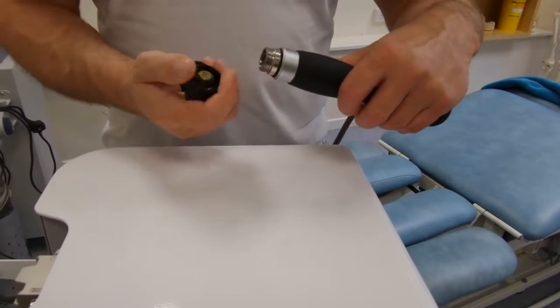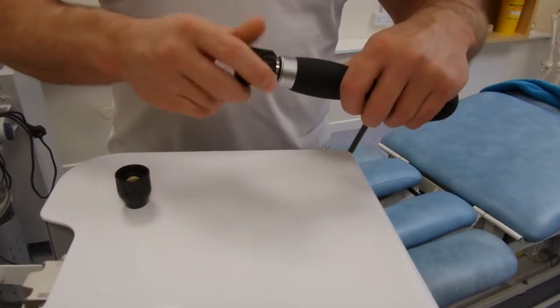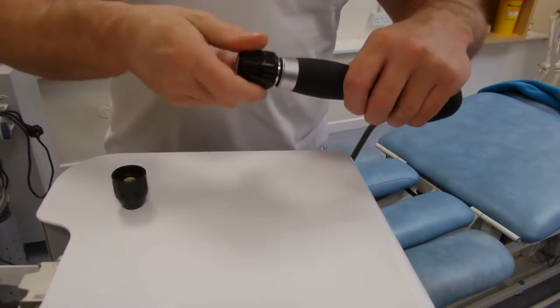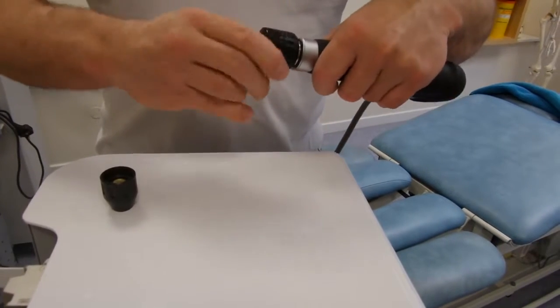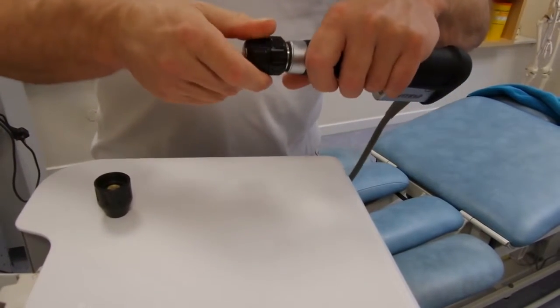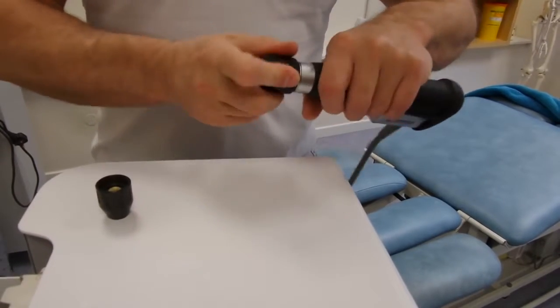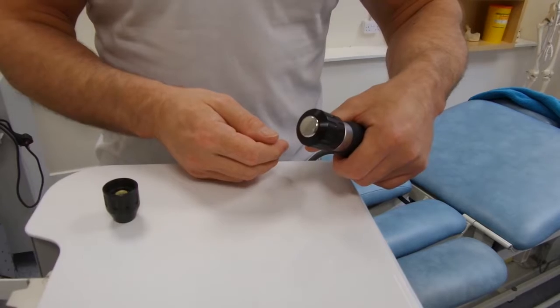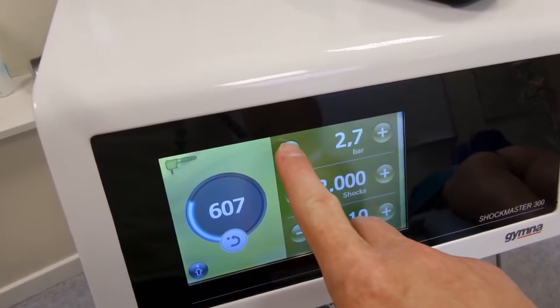We're now going to switch the deep impact applicator and put on the 20mm head. Sometimes the heads can be difficult to get on, especially if the machine's warm. I'd suggest just rotating them backwards before you rotate them forwards so you don't cross the threads. There's the 20mm head. We're going to turn the pressure right down now.